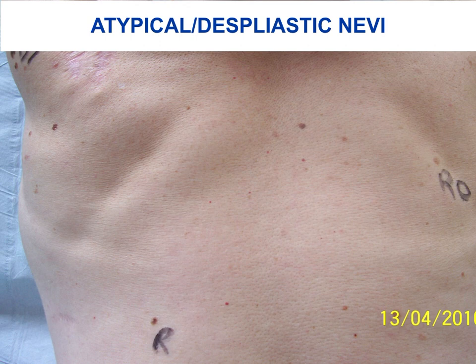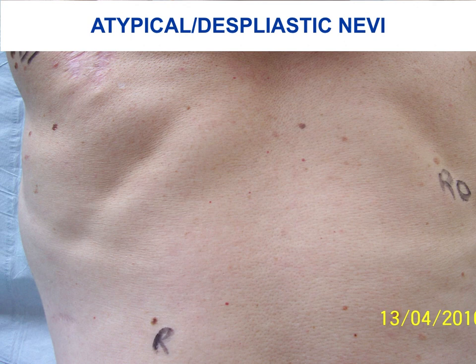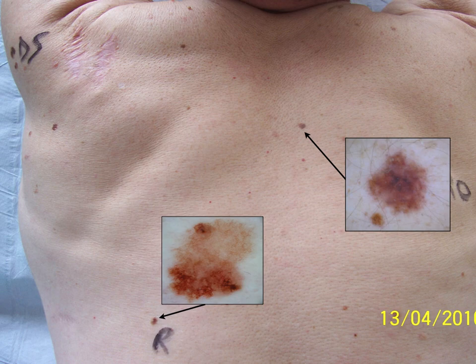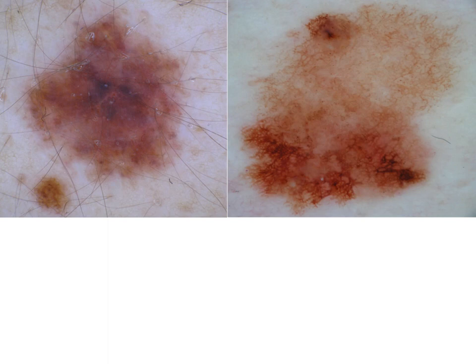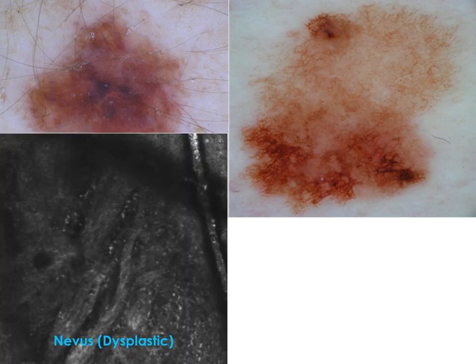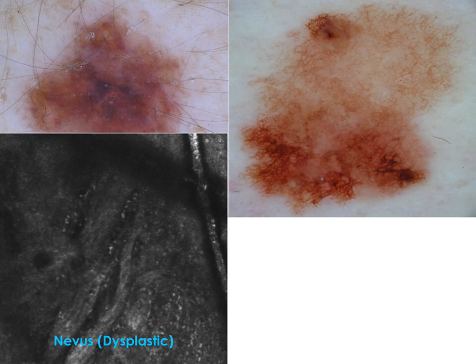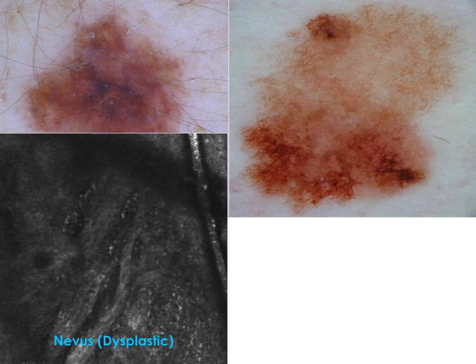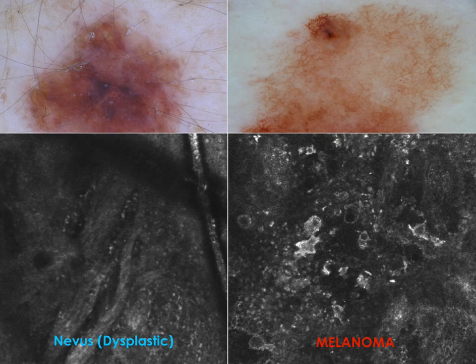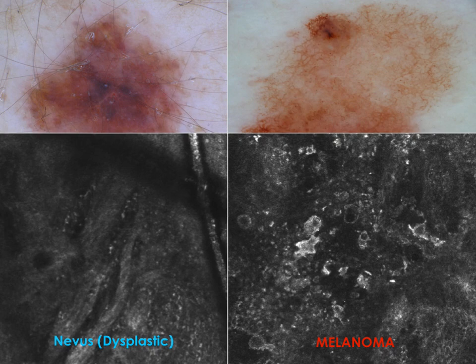The best indications include diagnosis of atypical dysplastic moles, especially in patients with multiple atypical moles. Taking two lesions as examples: at dermoscopy, both are equivocal and melanoma cannot be ruled out. However, the first lesion presents elongated nests without significant cytological atypia, supporting a diagnosis of nevus on confocal; whereas the second lesion shows prominent cytological atypia with pleomorphic and highly reflecting cells, corresponding to the diagnosis of melanoma.